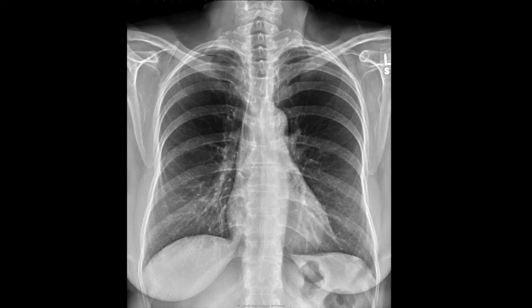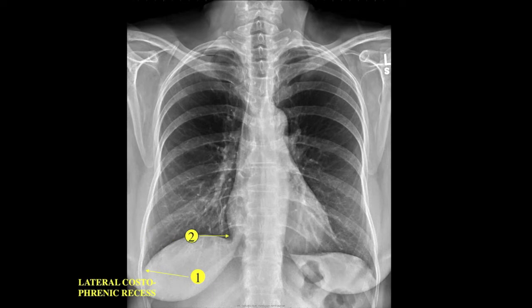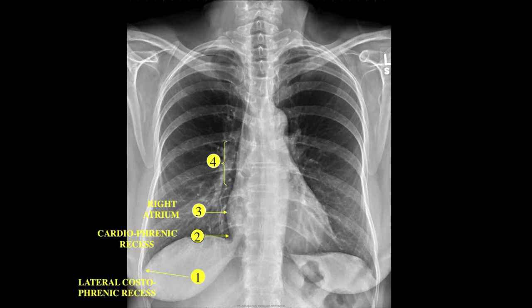PA radiograph of the chest — upright, and we know that because we have gas in the fundus of the stomach within a centimeter from the left diaphragm. Just to visit some of the important anatomical landmarks: the right lateral costophrenic recess, the right cardiophrenic recess, the border of the right atrium, and the right hilum, which is mostly vascular structures as seen on the PA radiograph. Lymph nodes are not usually visualized unless they're calcified or enlarged.